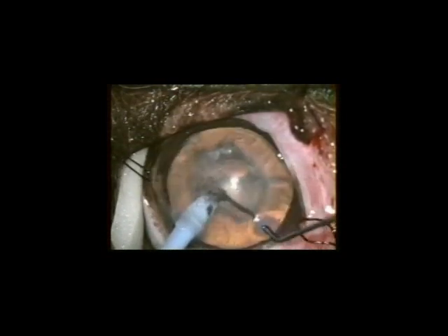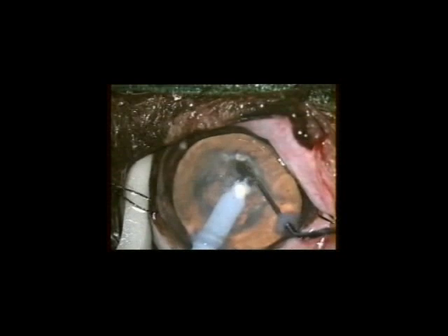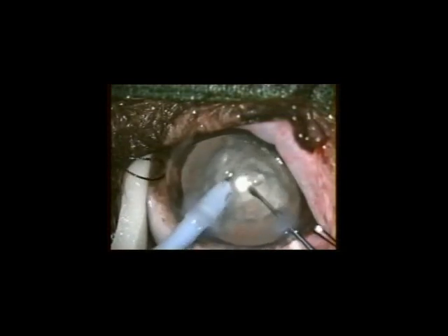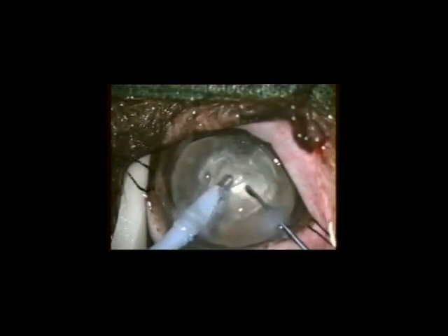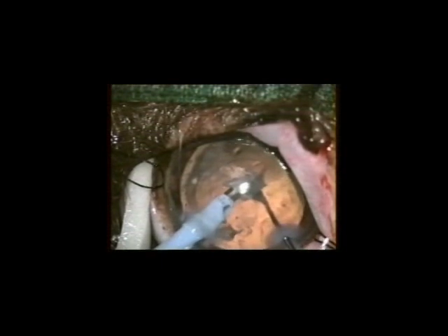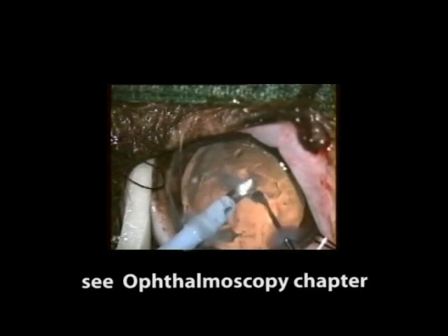If owners are interested in surgical cataract removal, it is advisable to refer cases early while preoperative assessment of the retina can still be performed using ophthalmoscopy. Surgical outcomes are also better when cataracts are removed in their early stages. Early cataracts can be easily identified using a procedure known as distant direct ophthalmoscopy, which is ideally performed as part of routine ophthalmoscopic examination.